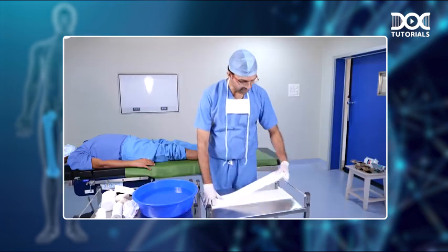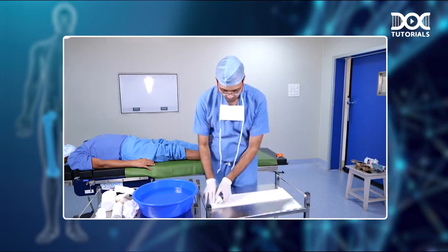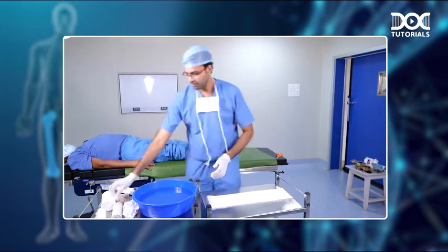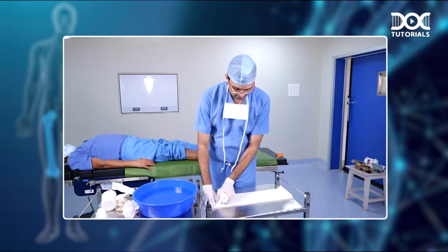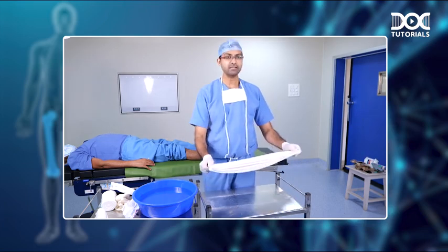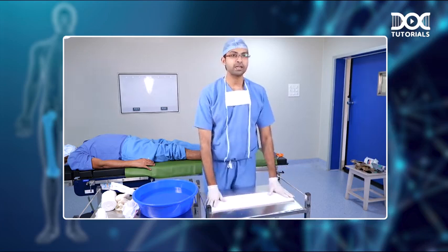Once you do that, next step is to make a slab by layering the POP one layer at a time on top of each other. Generally for below knee slabs, we need 2 POPs like this. So this is our below knee slab ready. Now we'll see how we can apply it on the leg.